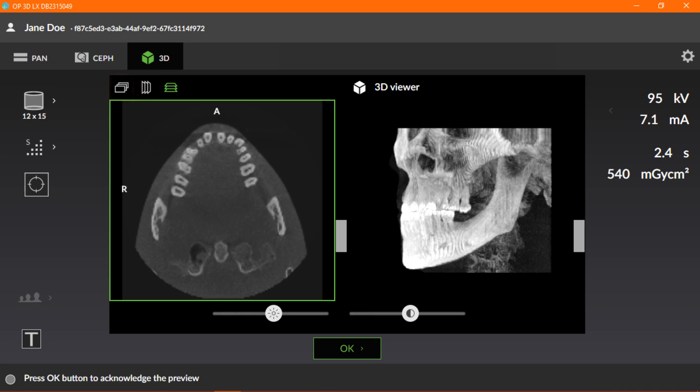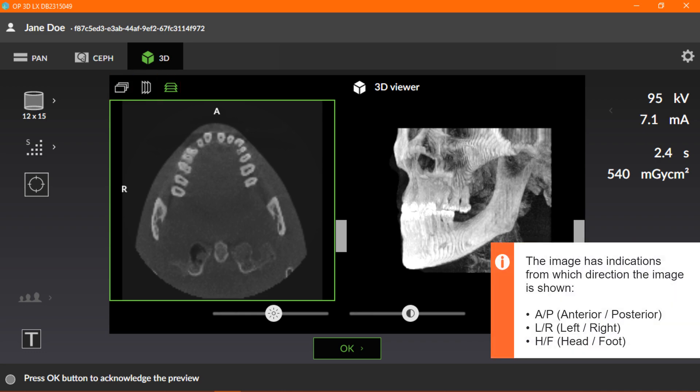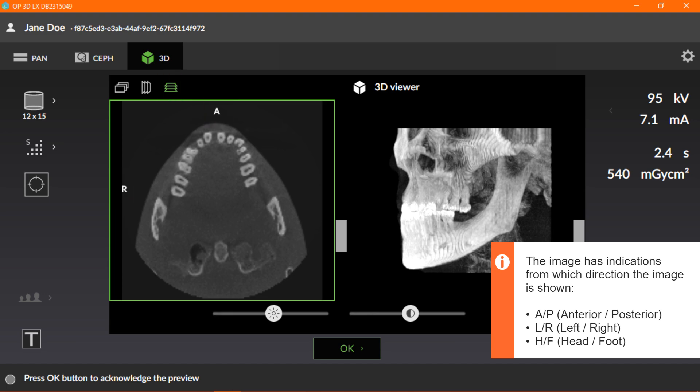The slice preview can be projected in three different views: coronal, sagittal, and axial. The image has indications from which direction the image is shown. Here, the axial view indicates A for anterior and R for right. We'll look at the other direction indicators on the different views next.